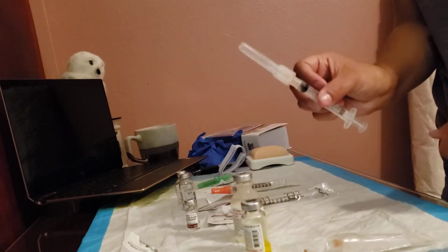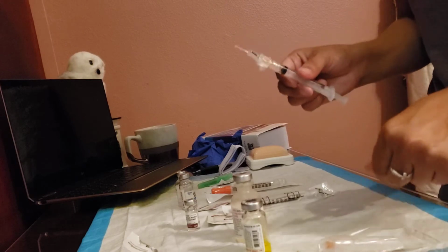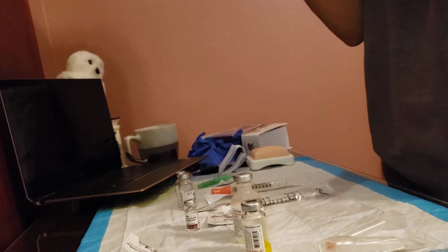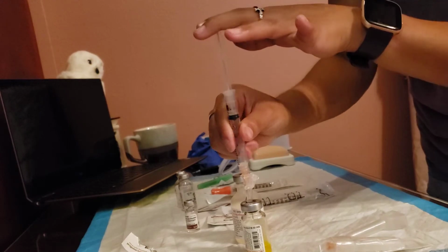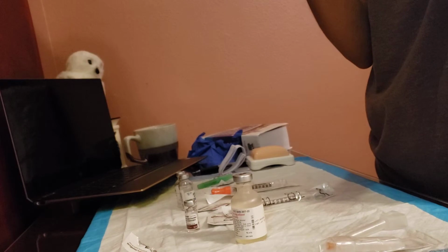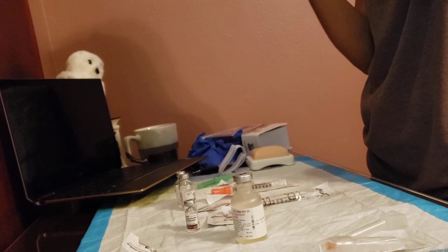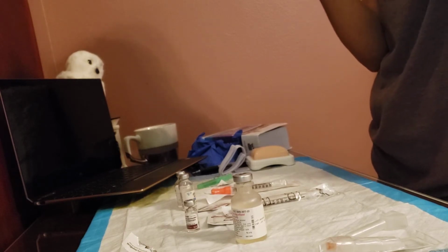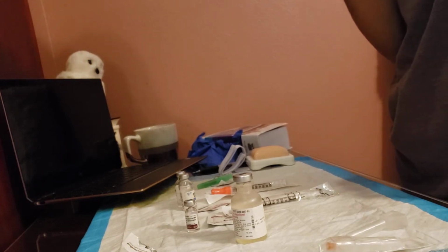And then with my same needle that I drew my sterile water up in, I'm going to draw it into my syringe. So again, I'm going to get 2.5 of air, inject my air, and then pull out my med. I would be using a 23 gauge and a 1-inch long needle, but I didn't have any of those in my kit, so right now I'm using a 25 gauge.